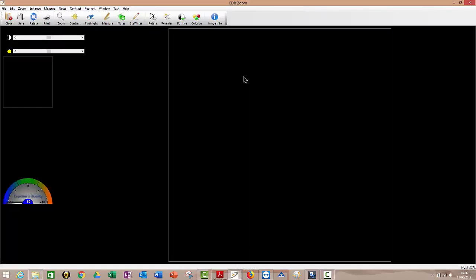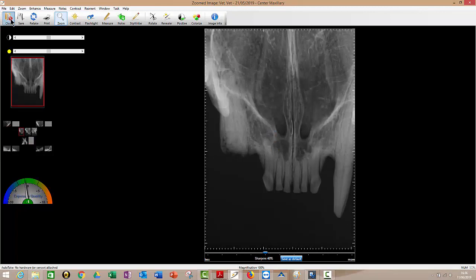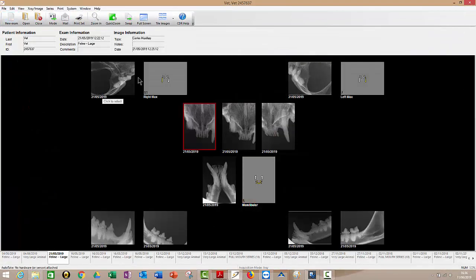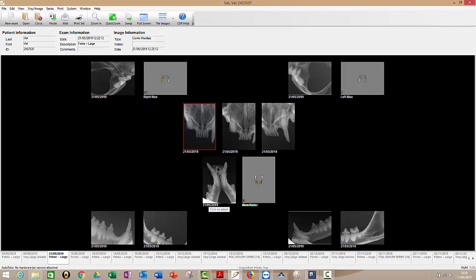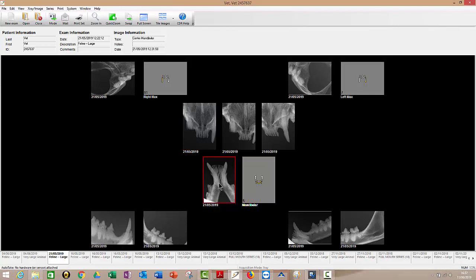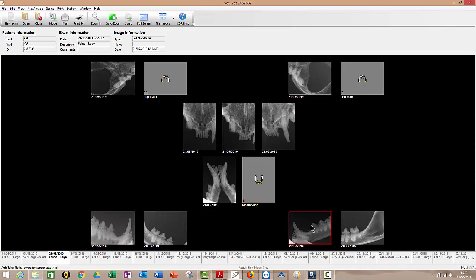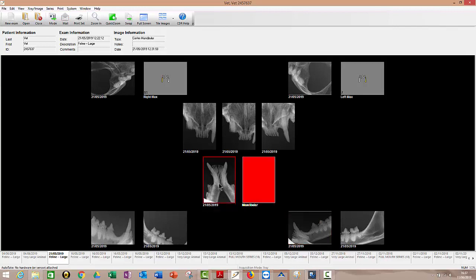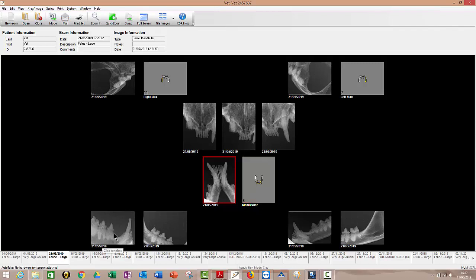Then I would have done the maxillary in each case. The maxillary molars in each case. And then I would have turned the cat over into dorsal recumbency. And I would have put the sensor in sort of canine to canine. And taken that shot there. And by the way, this shot here is taken at about 70 degrees to the sensor. And then I would go slightly round the corner and actually point it at the premolar there to take that view. And leaving the sensor where it is, just go around the other corner and fire at that premolar to get that view. So the sensor hasn't moved. The sensor is still in its, it's been put in the cat's mouth portrait rather than landscape over the canine to canine area.